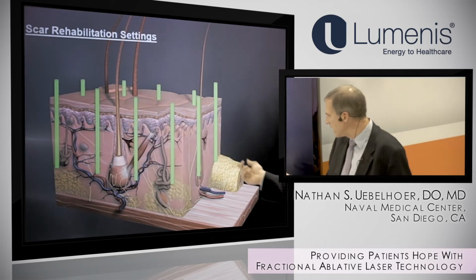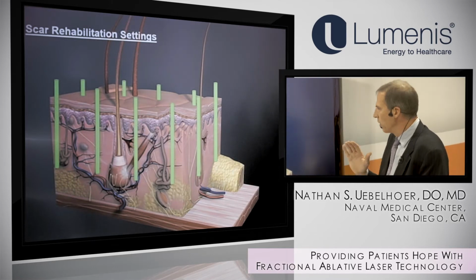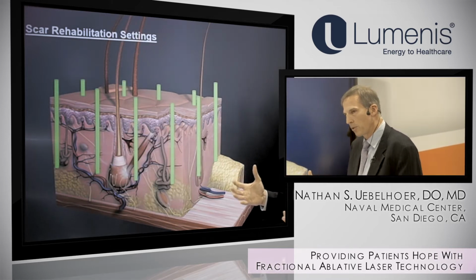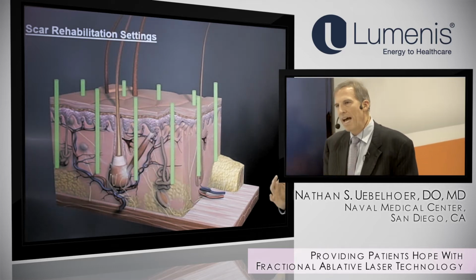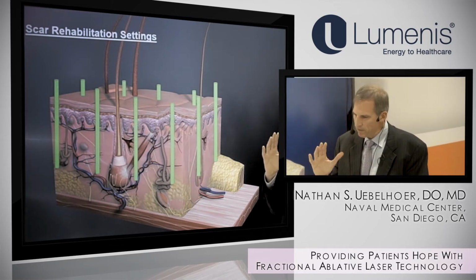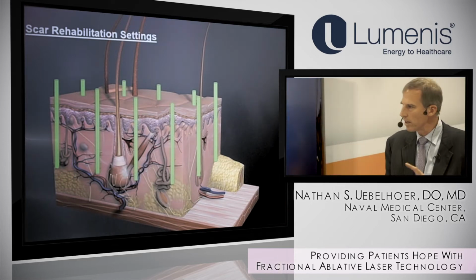Also, we're going very deep into the skin. We're actually matching the energy with the scar. So if the scar is 3 millimeters deep, we want to turn it up to an energy that's going to get us close to 3 millimeters. We haven't gone into the fat on purpose, at least, and we find that you don't need to. You don't need to do the full depth of the scar, but we try to get as deep as we can within the scar based on the energy.